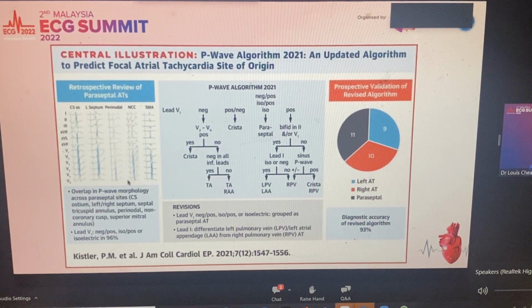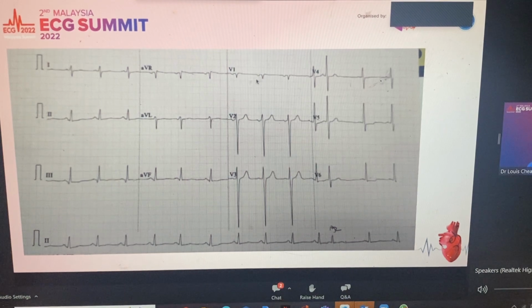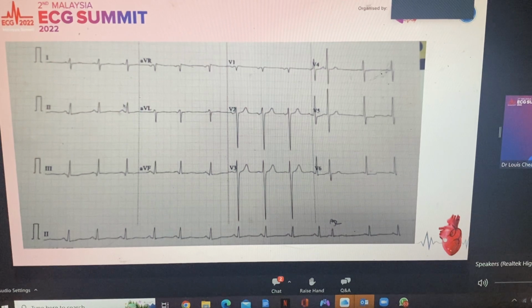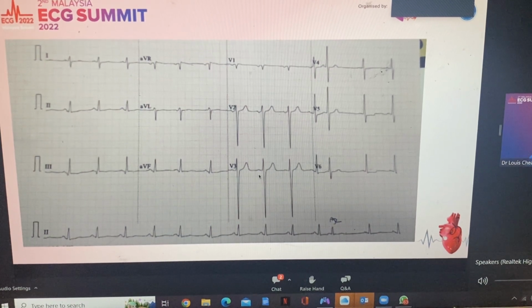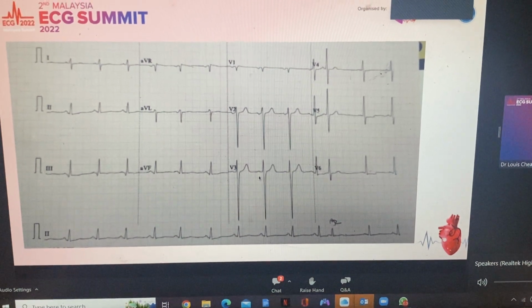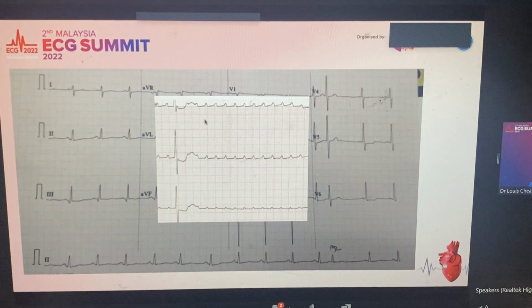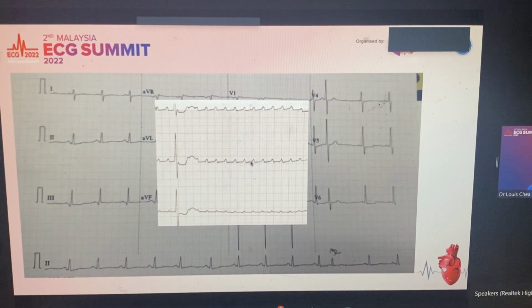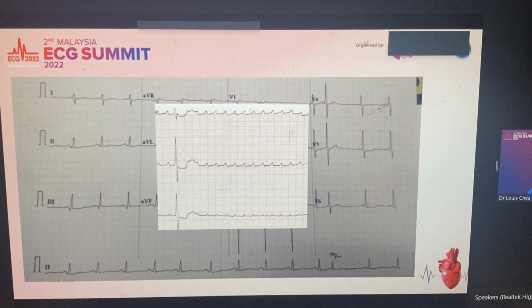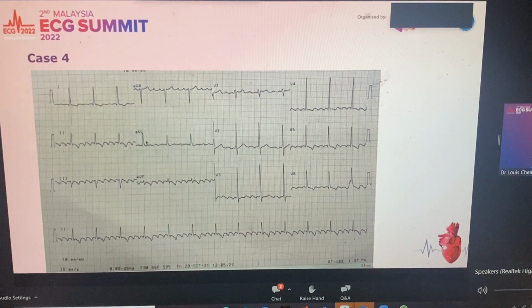And you can see the sinus rhythm ECG: the P wave here went from positive to negative, and here from negative to positive. This became a normal sinus rhythm ECG. I do not have the termination ECG here. If we had given adenosine for the previous ECG, likely what we would see is this, where there would be a termination of QRSs, and there would be a marching on of the P waves here. So that would be diagnostic of atrial tachycardia, right? Okay, then our next case, something similar to our previous one.